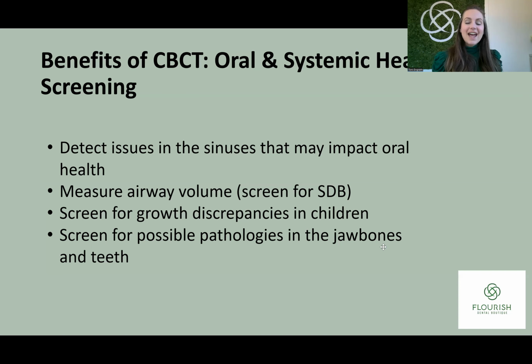We're looking at growth discrepancies in children because we can see the width of the jaws as they're developing. We can see how far apart the teeth are, where those permanent teeth are developing in relation to the baby teeth. And we can also screen for possible pathologies in the jaw bones and teeth that just can't be seen with a 2D X-ray, even the panoramic X-rays.